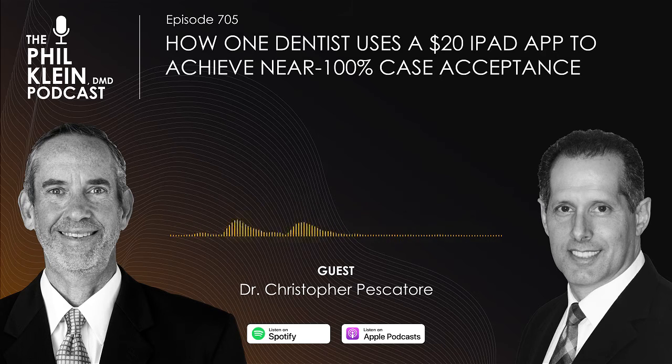Well, wax ups have changed. With the digital environment, the diagnostic wax up you get from a lab, to me, is not the same as we used to get before digital. Before, we used to get wax ups that were usually made with the lost wax technique, where you basically take that part of the tooth away and you just don't grind the teeth down and give someone a complete wax up. Because when you do that, there's a lot of extra material and bulk and occlusal adjustments.